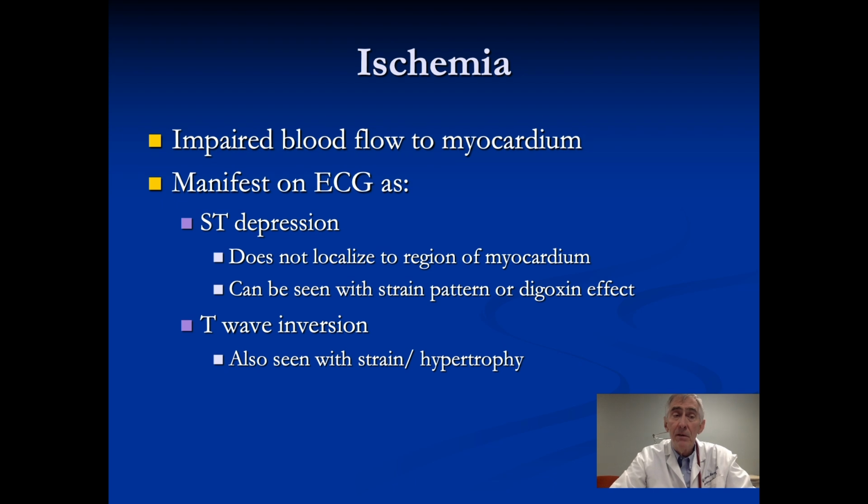Now, ischemia implies impaired blood flow, but not lack of blood flow. It's manifested on the EKG as ST depression. It does not localize the region of the myocardium as well as ST elevation. It can be seen, as we've seen already, with left ventricular hypertrophy.